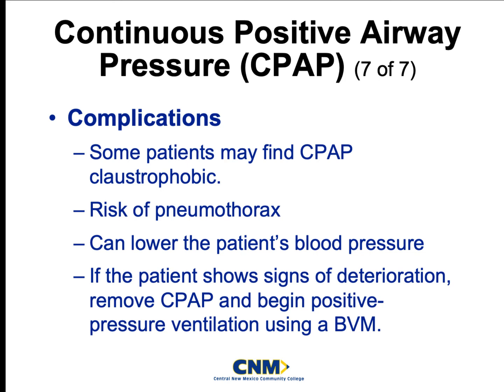CPAP, some patients do find it kind of claustrophobic. And again, this is all going to come down to your therapeutic communication with your patient, right? Letting them know that you're there to help them. You are there to cause no further harm. You are trying to fix their shortness of breath. You are trying to get them to do adequate gas exchange, and until they realize and take those first few breaths in, for lack of a better term, this is going to really suck for our patients, specifically when we are setting this up.